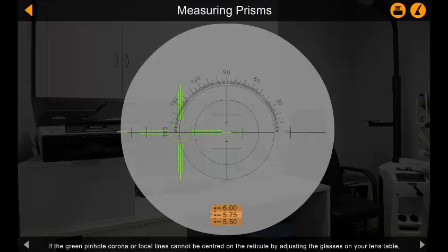If the green pinhole corona or focal lines cannot be centered on the reticule by adjusting the glasses on your lens table, then there is a prism present in the lens.